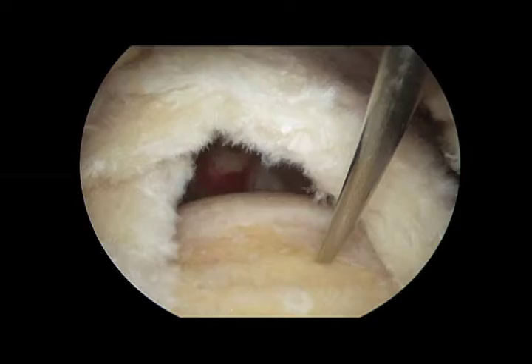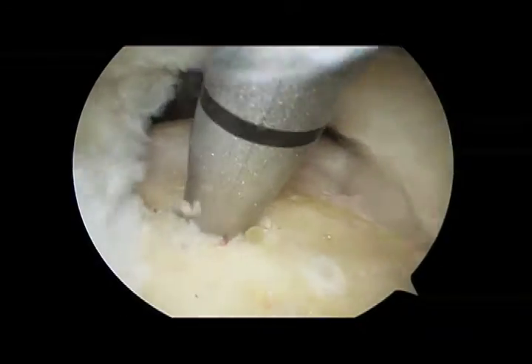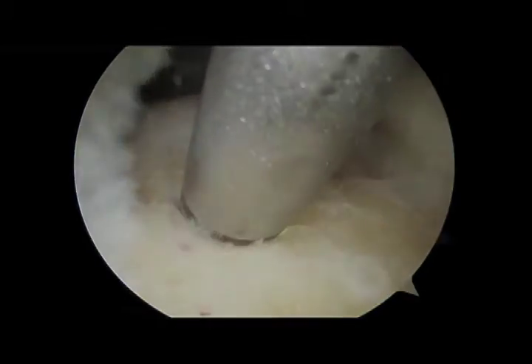Using a spinal needle, we identify an appropriate location and trajectory for our anchors prior to making a stab incision. Once we are satisfied, we proceed with placement of our posterior anchor. We prepare our pilot hole using a punch and follow this with a tap.